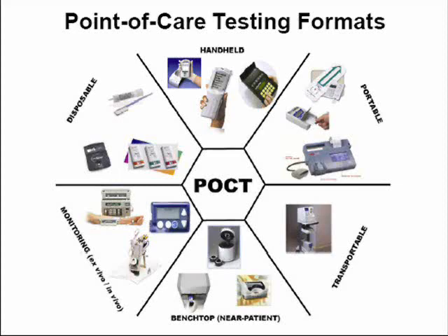The device in blue, shown in the upper right of this category, is an insulin pump with a wireless interface to a continuous glucose monitor. The glucose monitor measures glucose levels every few seconds to minutes, and this insulin pump wirelessly communicates with it to adjust insulin infusion rates based on the most recent glucose results. So as a type 1 diabetic, you won't have to worry about adjusting a dose and sticking yourself with a syringe after a meal or so forth.